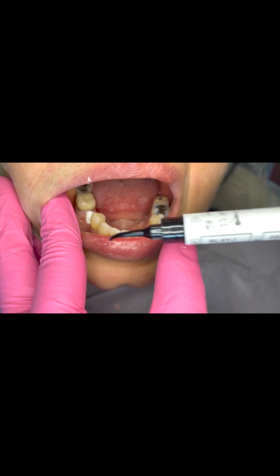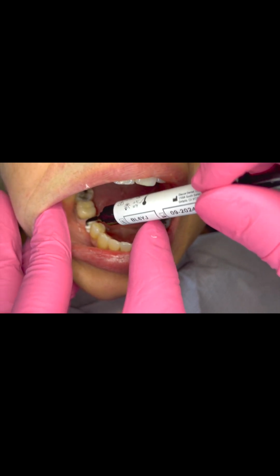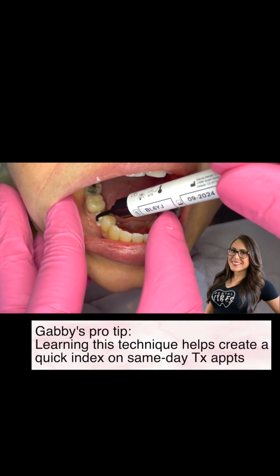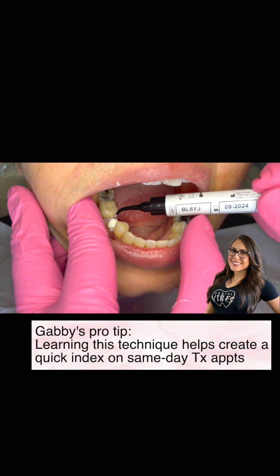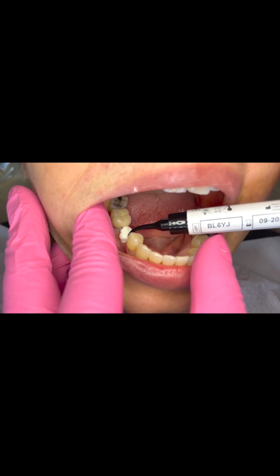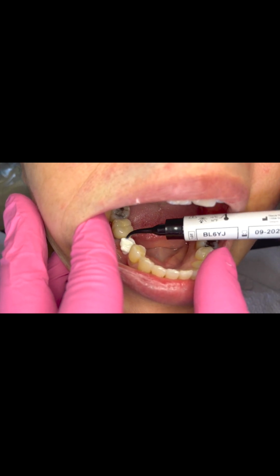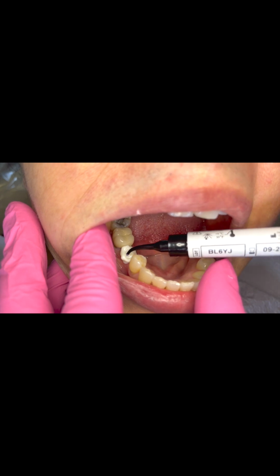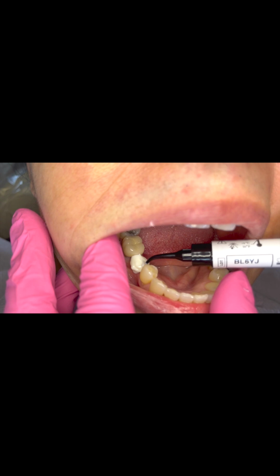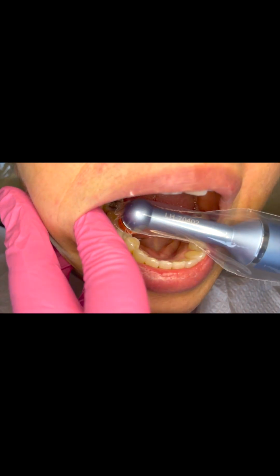So you put a little bit and then you cure it. This is not my favorite technique, and as you can see, I'm not very good at it. I think Gabby is a little bit better than me doing this technique, but it still serves a purpose, especially if you start that temporary bridge or you're starting treatment on the same day, let's say, of the limited exam, and you're like, oh shoot, how am I going to fabricate this temporary bridge? Well, you would add this and then take your impression.